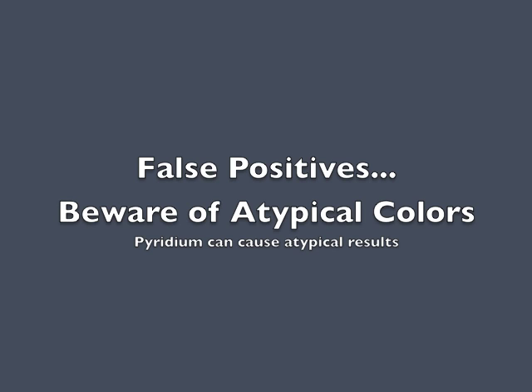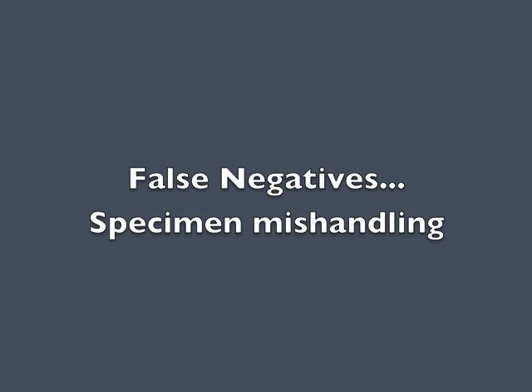Be aware of atypical colors when interpreting this test. A positive result will be purple to indigo, black, or brown. Sometimes Pyridium, an over-the-counter medication, can cause the urine to be an orange pigment and will cause the Ictotest to appear as a sort of fuchsia positive reaction — this is actually a negative reaction for bilirubin and should be reported as negative. False negatives can occur when the specimen is mishandled or exposed to light for too long and bilirubin breaks down.